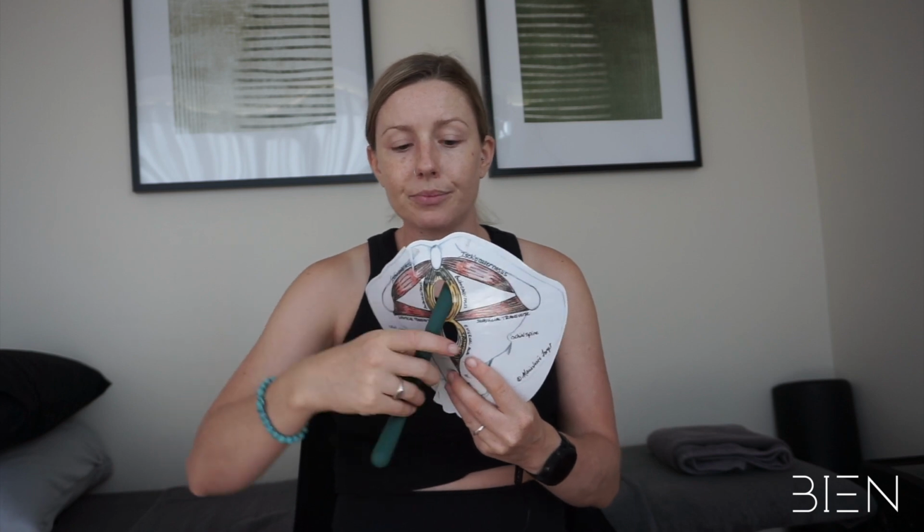So an inhale first, exhale, squeeze pelvic floor, inhale, relax pelvic floor and move. Exhale, squeeze. Inhale, pelvic floor wand down, lengthen and relax the pelvic floor. So those are a couple of techniques that you can try to help to lengthen and open the pelvic floor.